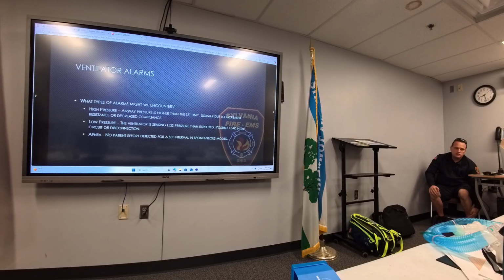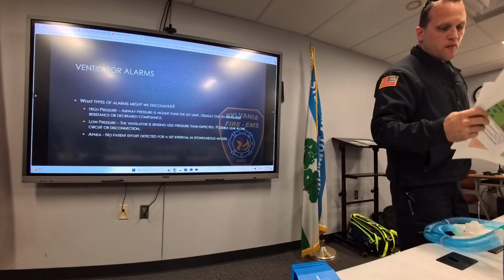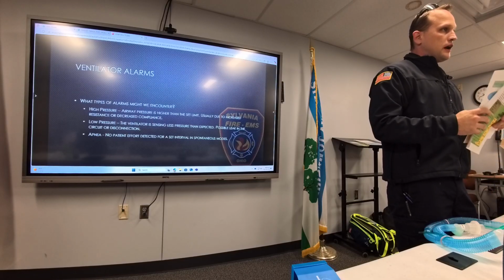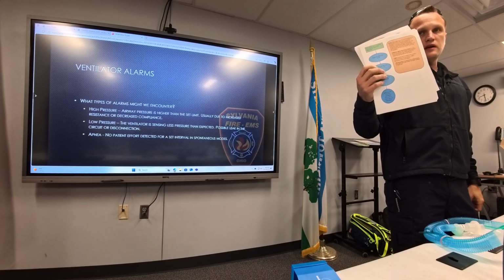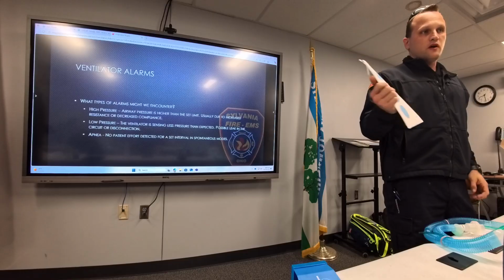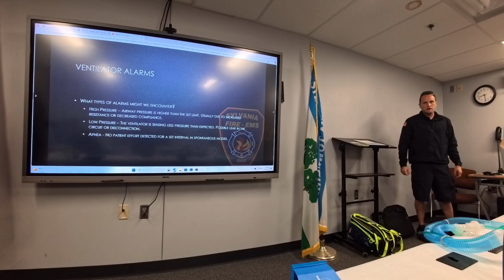So in front of you guys on your tables, there are some alarms that were brought up. Some of these are the common alarms that a lot of people were seeing. We went through and made a new picture diagram to walk you through how to resolve them. And on another side is an algorithm to help you go step by step through the causes that usually cause that alarm. So feel free to pass these down. You guys can look at them. These are still in the working phase, so if you have any more recommendations, we can get these adjusted.